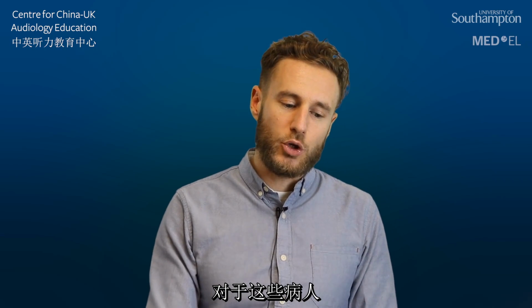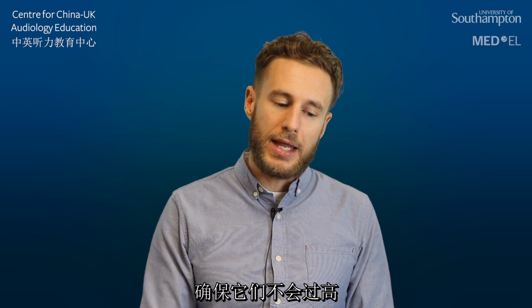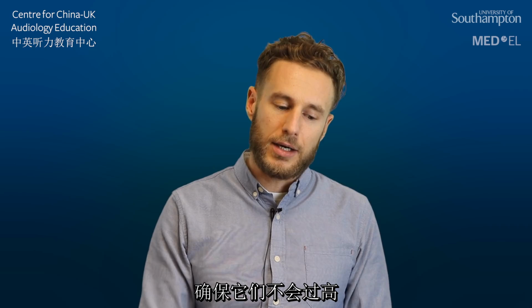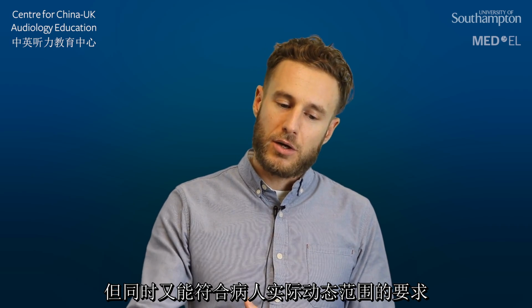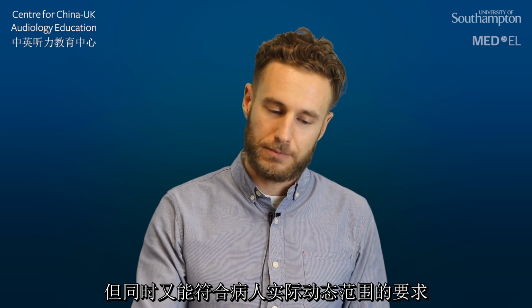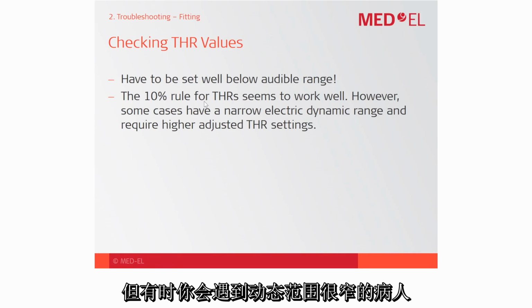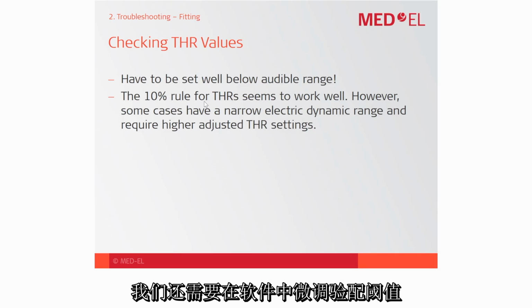In those cases, you could test the thresholds in the fitting software and make sure they are not too high, but nicely match the actual electric dynamic range of the patient. But again, keep in mind that they are below the audible range. So the 10% rule seems to work well, but in some cases you could be confronted with a narrow electric dynamic range and therefore need to fine-tune those fitting thresholds in the system software.